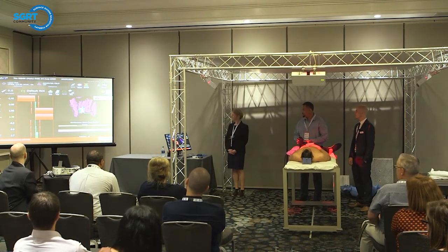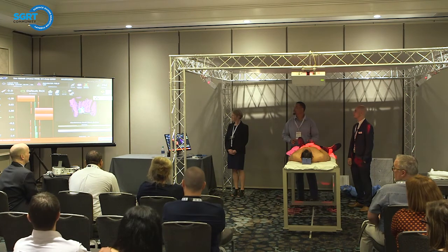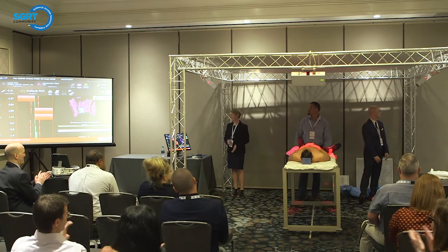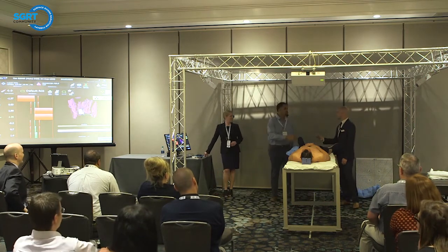Okay, great. Okay, good. Everything's within tolerance. Stop. Yeah. Okay, go ahead and round of applause. How long was it? 57. Okay. About 50 seconds, so that's pretty good. I mean, that's the hardest thing to set up with a rotational, right?